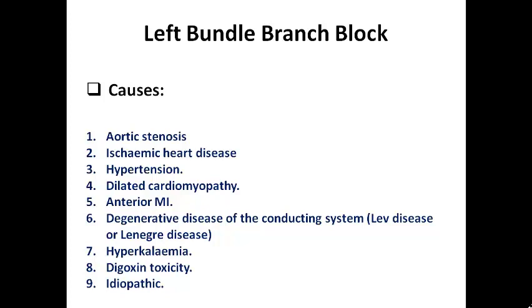But remember, in any patient with left bundle branch block, you should try to find a structural heart disease, and so this patient should have an echocardiography, not just reassurance. No, we need to exclude the presence of structural heart disease because it is a very common association with left bundle branch block.